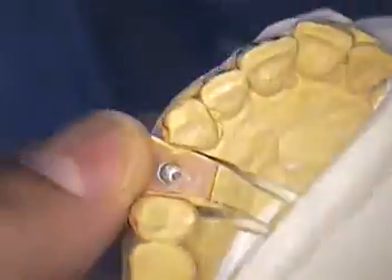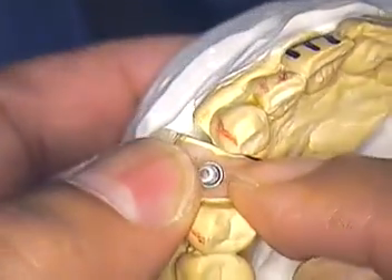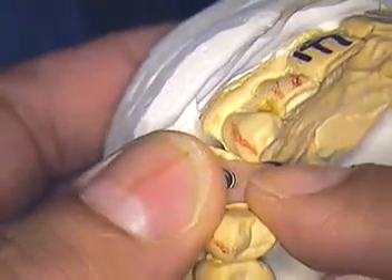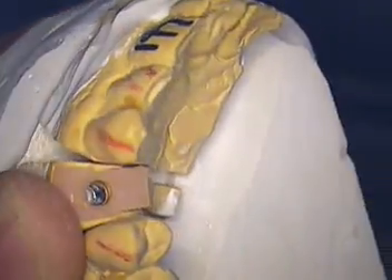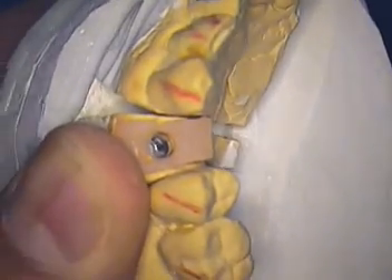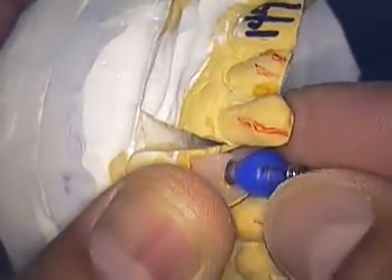Let me go back to our models. We've got the mounted case now. We try to keep it simple, so we went with the hinge. This is the soft tissue portion that the laboratory needs — they definitely need to cut out the model in order to use it and be able to put it in their hands. Again, transfer coping in place.